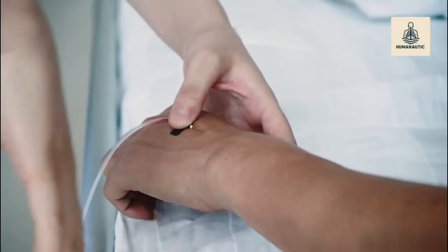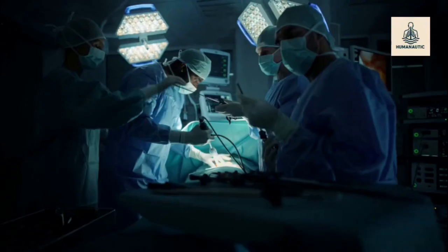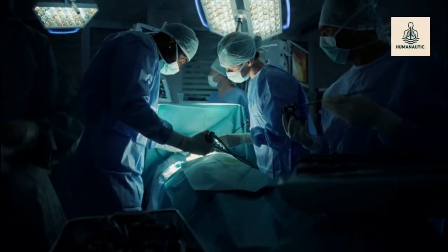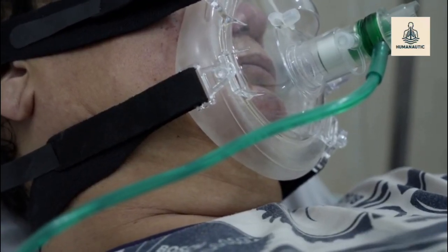Step 7. Inserting the tracheostomy tube. The tracheostomy tube is then inserted into the tracheal opening. The obturator is removed, and the tube is connected to oxygen or ventilatory support. Proper placement is confirmed by observing chest expansion and airflow.